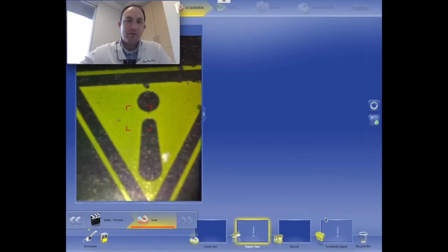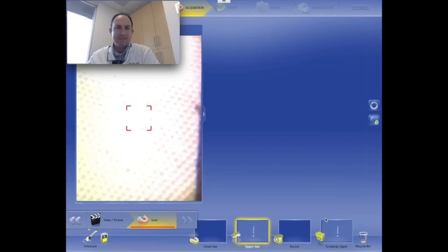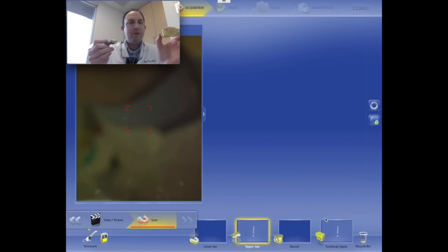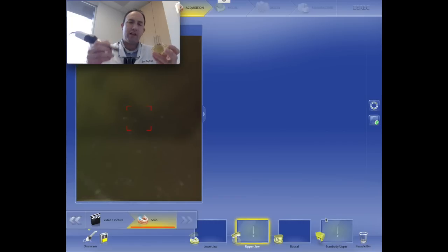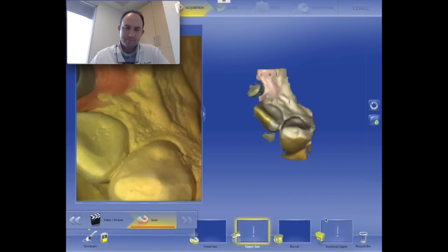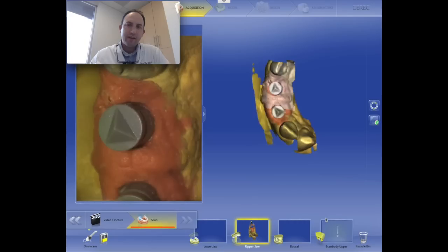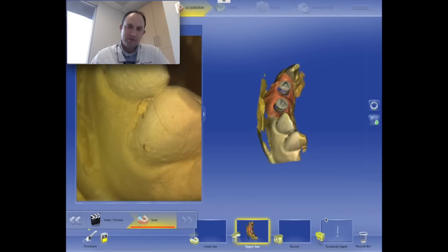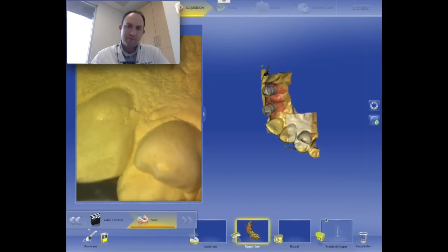Okay, so here's the camera, right? Let me wipe off some of that disinfectant there. Positioning wise, generally if this is a patient in the mouth, they'll be laying roughly in this orientation. So I like to try to use a fulcrum here, but I'm going to go ahead and just start scanning. You'll hear the clicking there. And I like to tell my patients that clicking is not a Geiger counter. There's no radiation involved, but that each of those clicks is a photo. And basically this is a video camera.